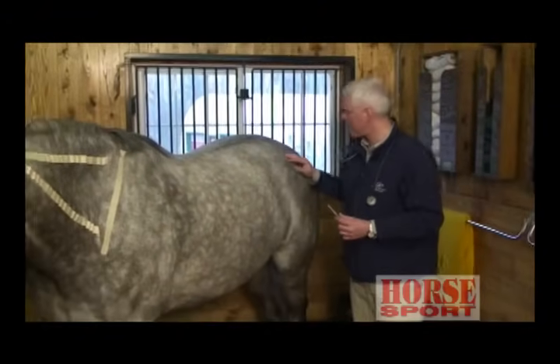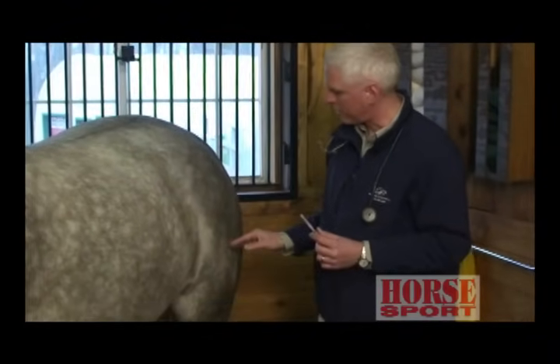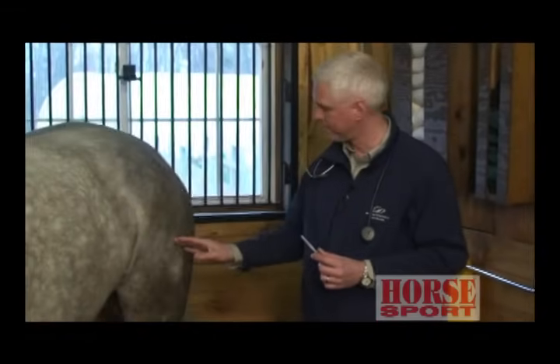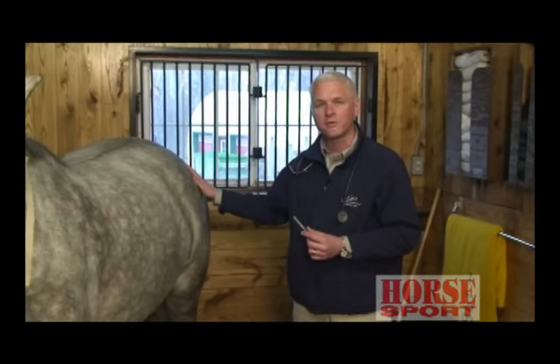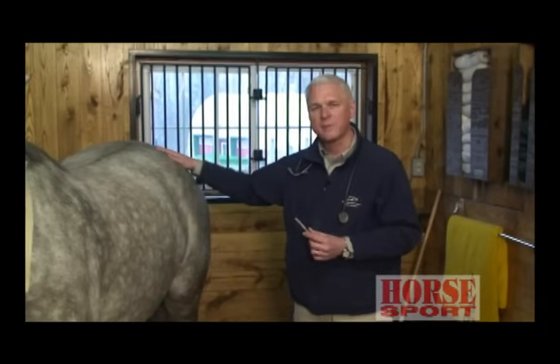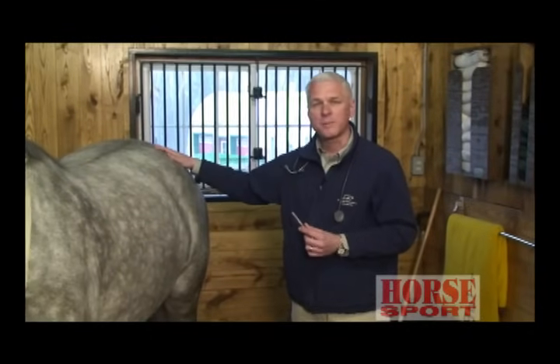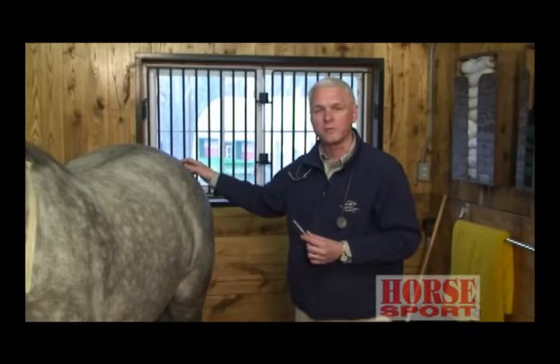If we move further back, up here there's a lot of muscle that we can inject in. We'll also inject in here, and finally right in the back. The problem with these areas is that horses don't like getting a needle — they will kick out, so there's a bit of danger for the person administering the medication. We also worry about side effects: if there is an abscess, which happens rarely but can happen, it can cause some damage to the muscle back here and affect how the horse moves.